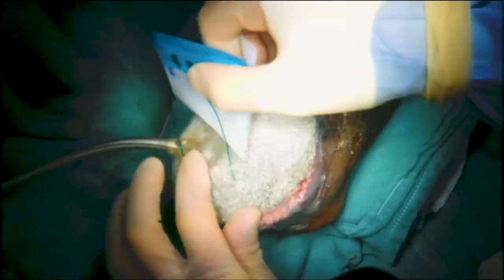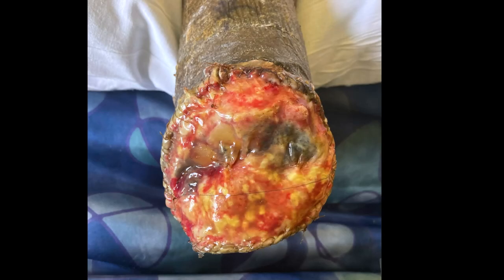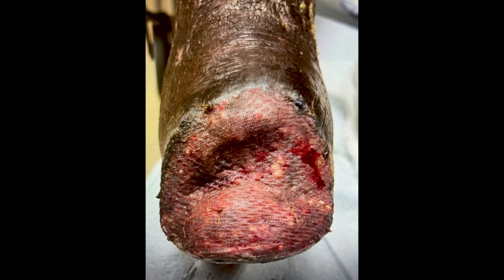The wound vac is to be changed three times a week until the Integra wound bed is ready for skin grafting. This is a look at the wound during the first wound vac change a few days after placement. It is recommended by the manufacturer to wait three weeks after Integra placement before skin graft placement. Here is the wound after definitive coverage with Split Thickness Skin Graft placement.